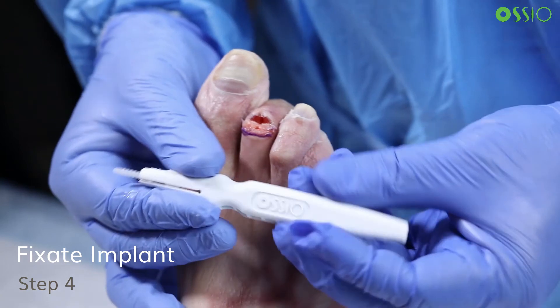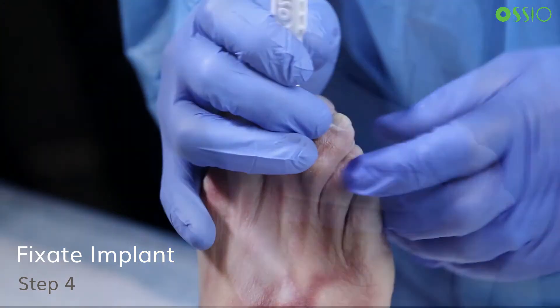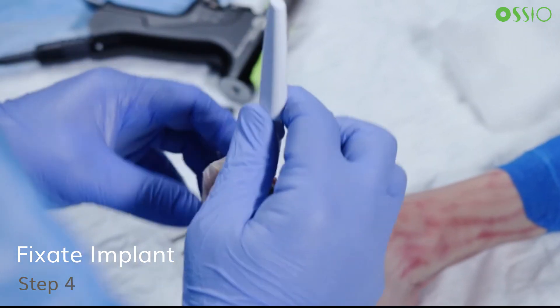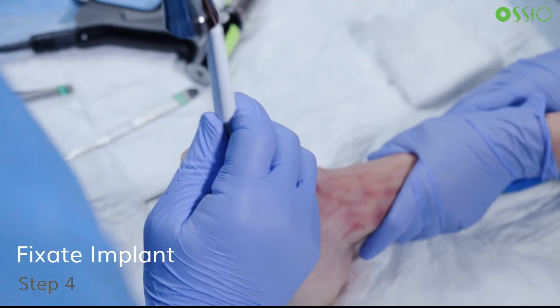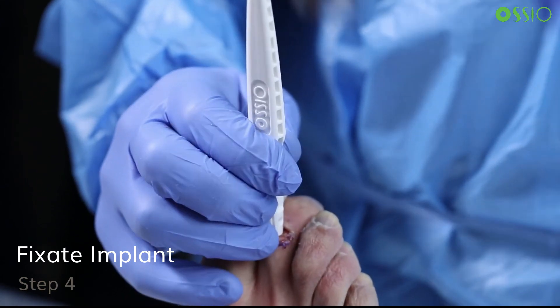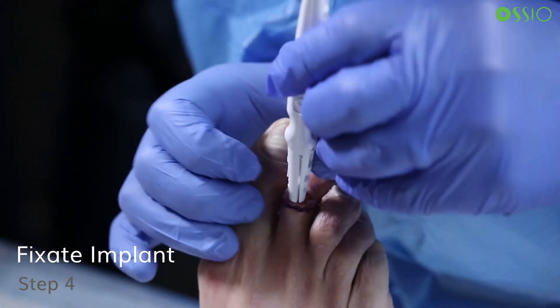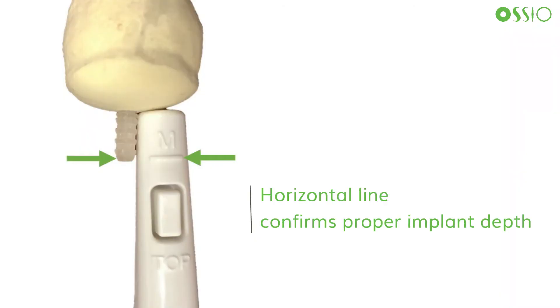Insert the proximal end of the implant into the proximal phalanx until it is flush with bone. It is best to remain perpendicular to the joint surface to prevent diverging from the bone tunnel. Tactile feedback will be noted once the inserter is flush with bone. Occasionally with hard bone, resistance is felt during insertion — do not apply excessive pressure. Gently tap the end of the inserter with a surgical mallet to advance the implant appropriately into the tunnel. When the inserter bottoms out against the proximal phalanx residual head, this indicates the proper depth is achieved. Use the release button to disengage the implant safely from the inserter without impacting its position within the tunnel. There is a horizontal line on the inserter which serves as an optional visual aid to confirm proper implant depth into the proximal phalanx.